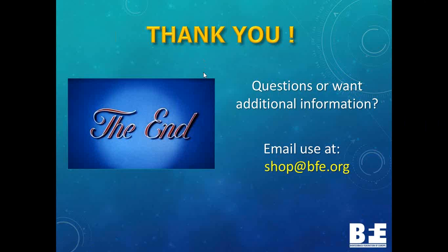A quick question from Daniel. Again, repeat, when is the update available? So the update for the ClinicalQ and BrainDryvr suite, it's going to be out in about 2 weeks. We're going to email everyone, and we'll have notifications on our website. And so you'll be notified, hey, here's the link so you can download the new version of the software. For the ClinicalQ Report Writer, it's already up on the website. It's already available. All you have to do is go to clinicalqreport.com, and you can see it right there.